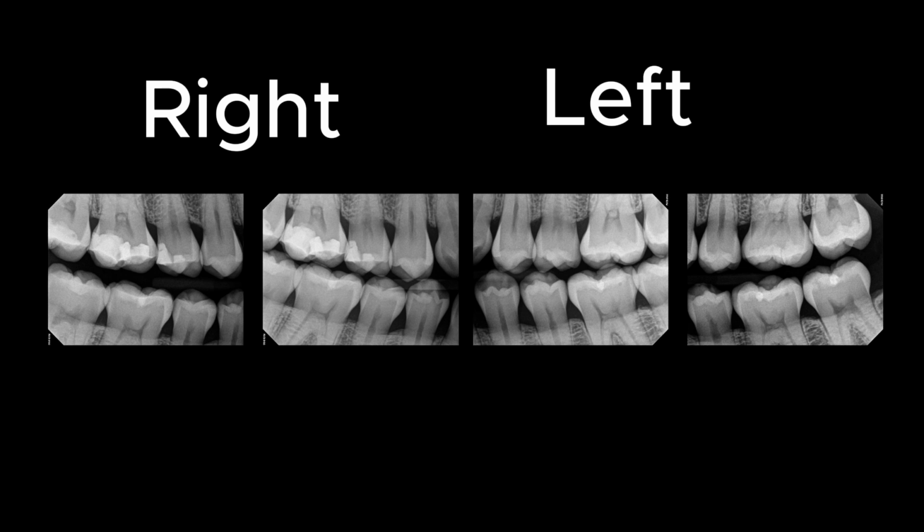On the right side, however, they did a great job of getting both the maxillary and mandibular canine, the distal of those canines, in the image. They opened the contacts and the bone levels are showing. On the molar view, they opened the contacts.